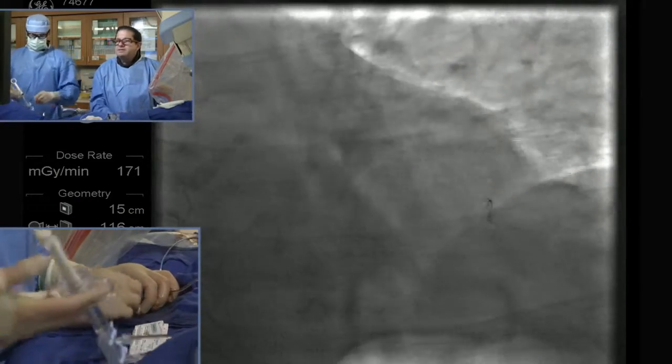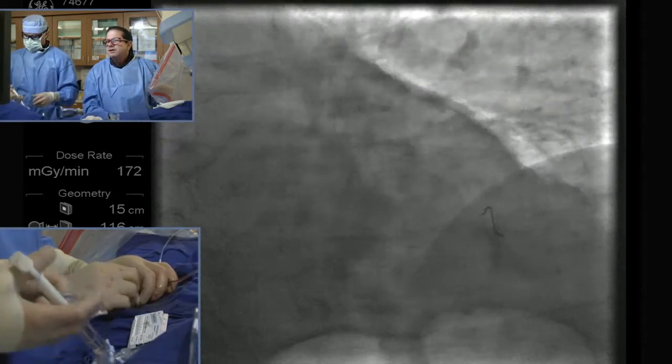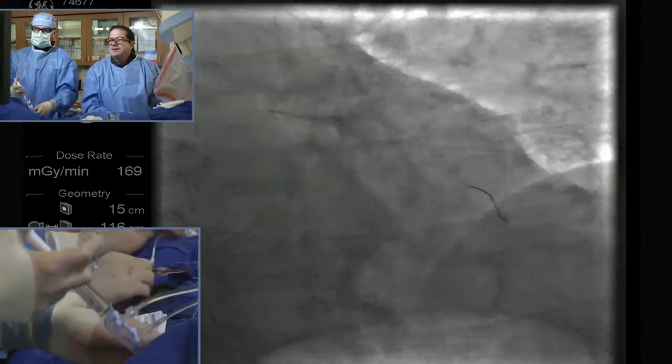So we have a Godzilla behind us. We're putting in a stent over the wiggle wire — over hill and dale. Let's see how it goes. And as you see, it goes really easily. Not.